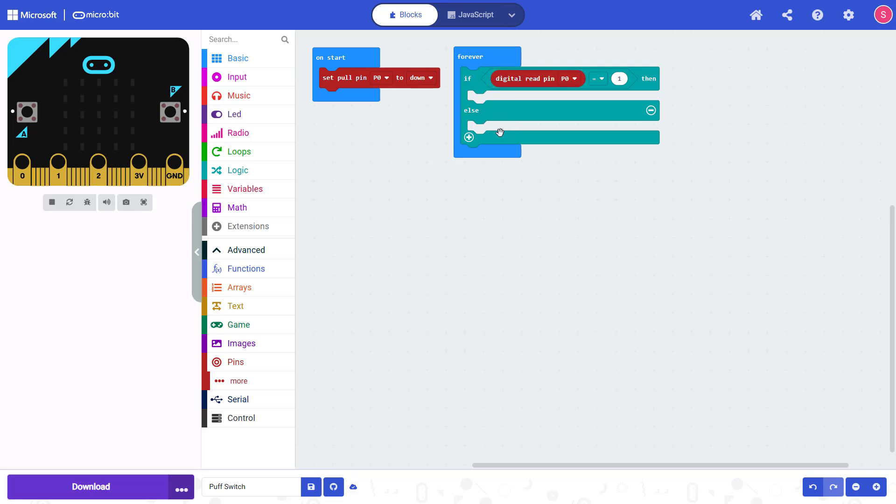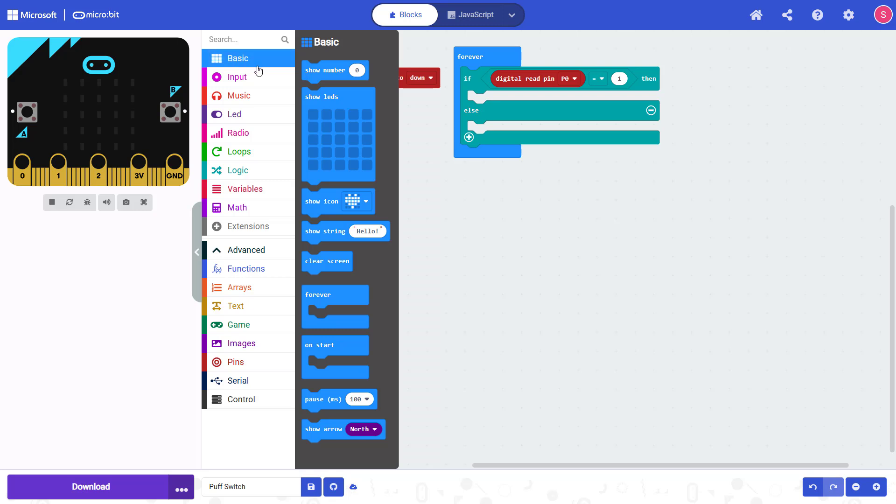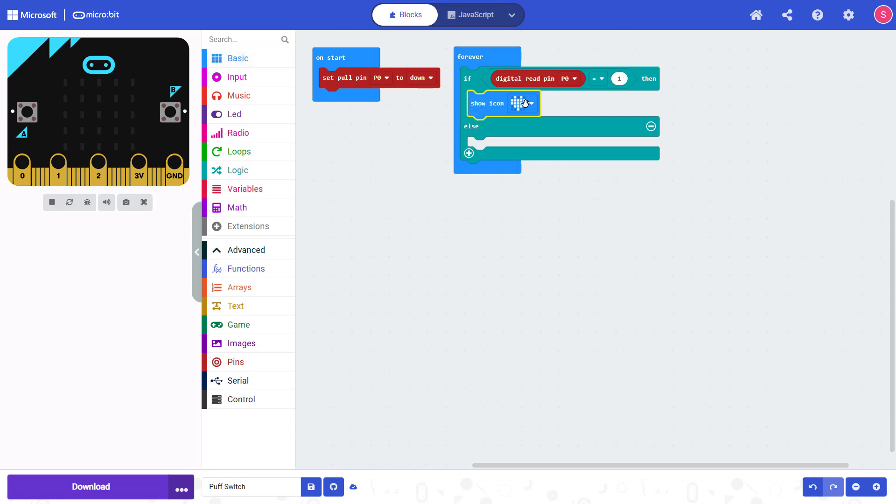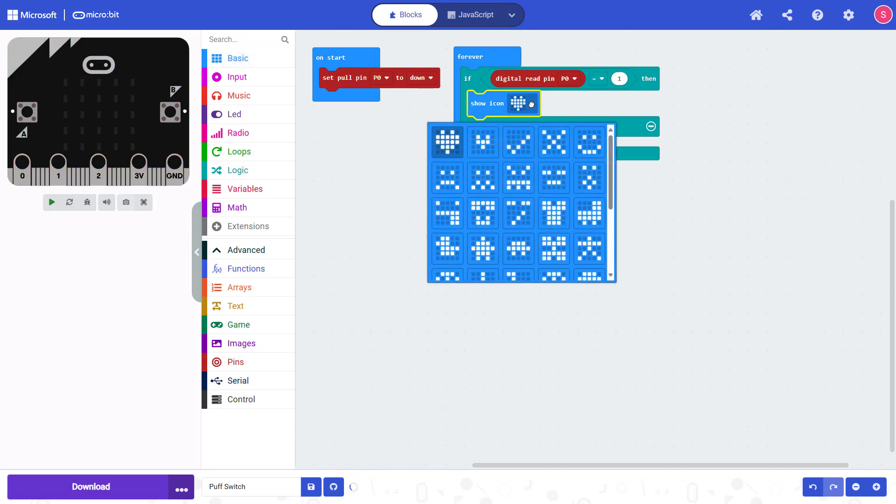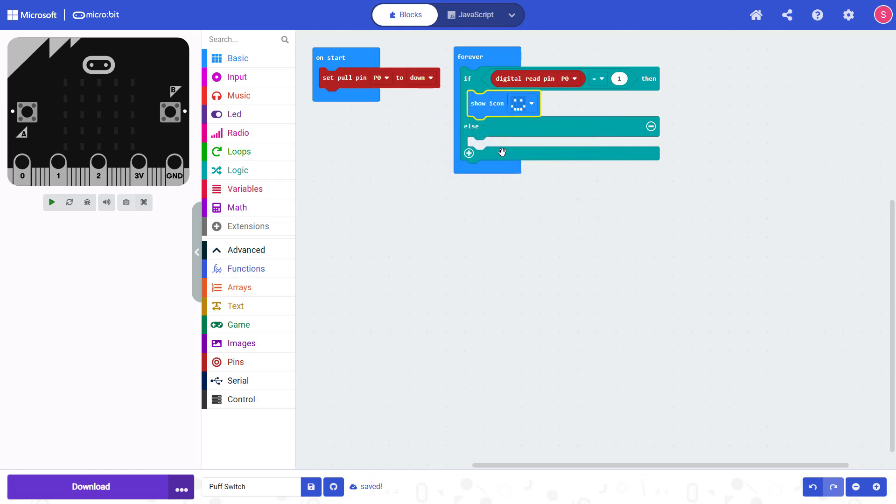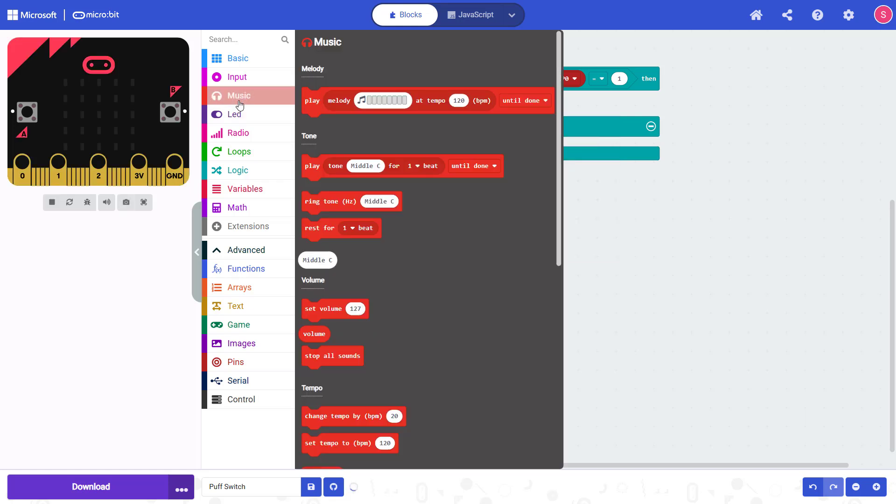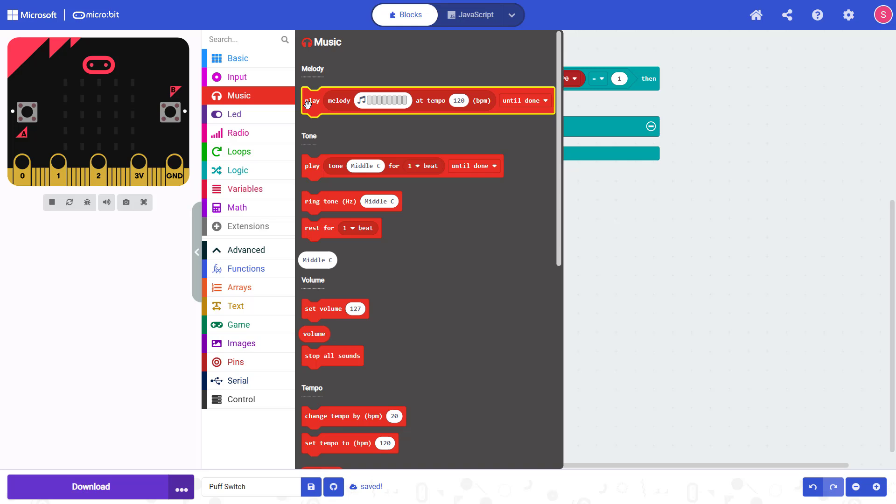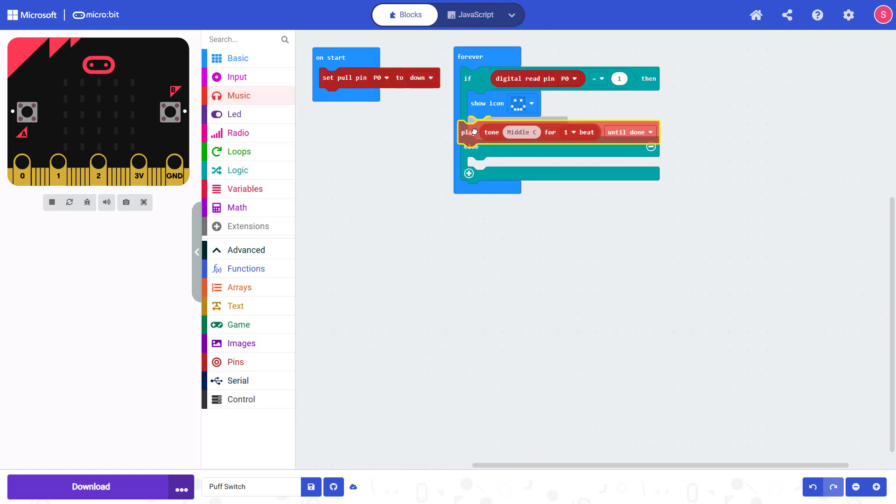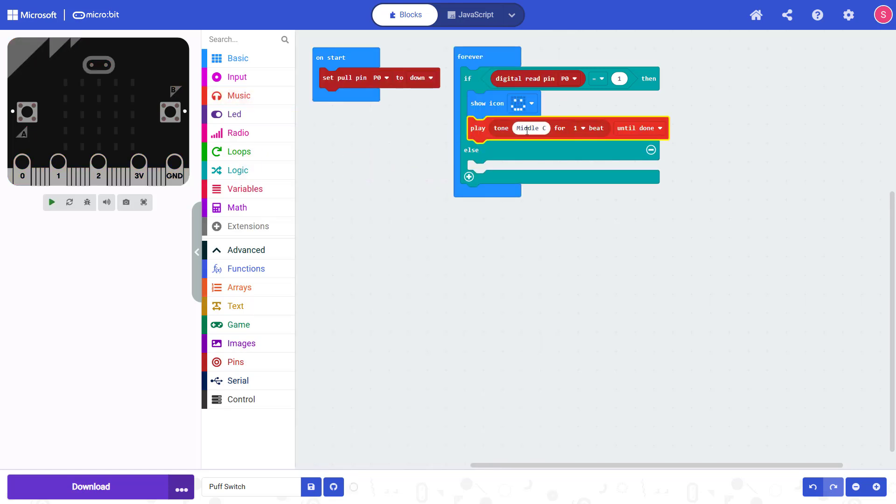So now you can fill whatever code you want into the if-else statement depending on what you want to happen when the switch is closed and when the switch is open. For example if you want to show a smiley face and play a buzzing sound like I showed earlier in the video, you can go up here to Basic and you can either draw your own icon with the grid of LEDs or use the available icons in the drop down menu with the show icons block. So I'm going to select the smiley face, and then you can play sounds, either single notes or musical melodies from all of the different options here under Music in the menus. So I'm just going to drag out the default play tone middle C for one beat.